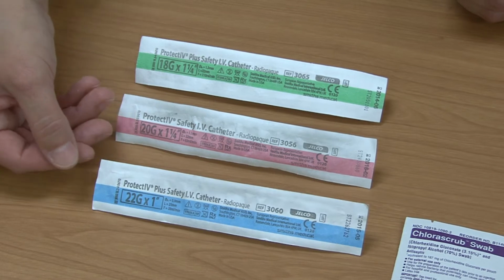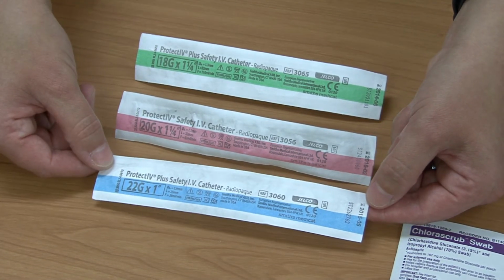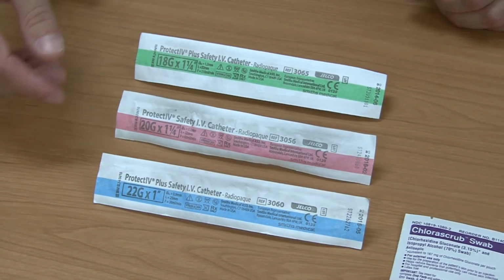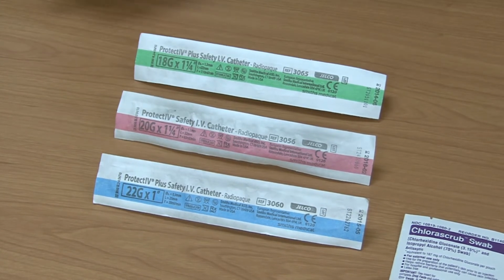Whenever you do take your catheter out of the package, you definitely want to assess it for clean, dry, and intact and that the date is within range. When you take it out of the package, you want to make sure that the catheter is clean, dry, and intact, and that it's not bent and doesn't have any issues with it either, and we'll come back to that.